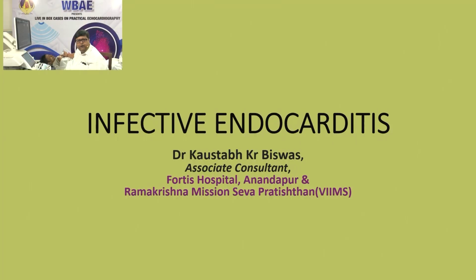Today I'm going to demonstrate a case of infective endocarditis of the mitral valve on this patient. He is a 61-year-old male patient with history of fever with easy fatigability for 1 month, and he has a positive blood culture for Streptococcus sanguinis, and he has come to our lab for echocardiography. Now, echocardiography plays a key role in the diagnosis and management of infective endocarditis.